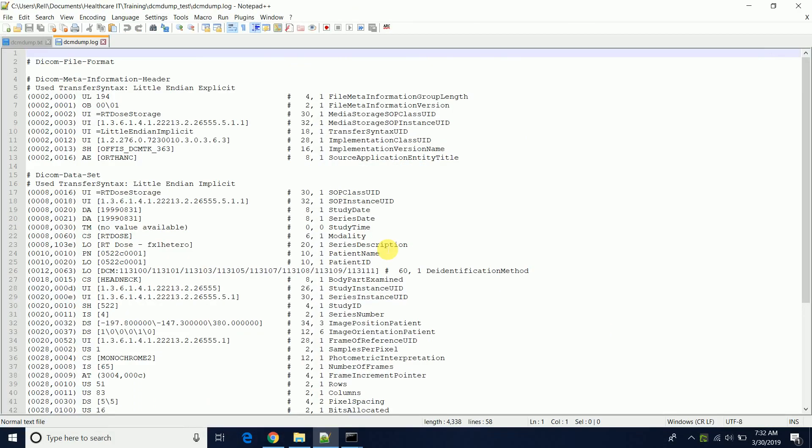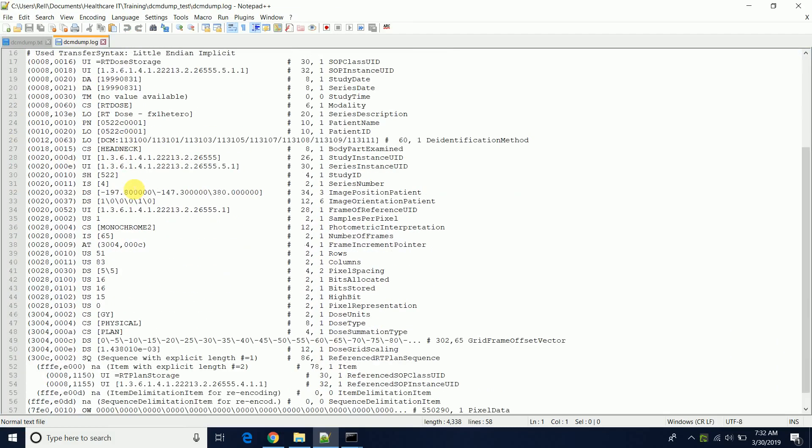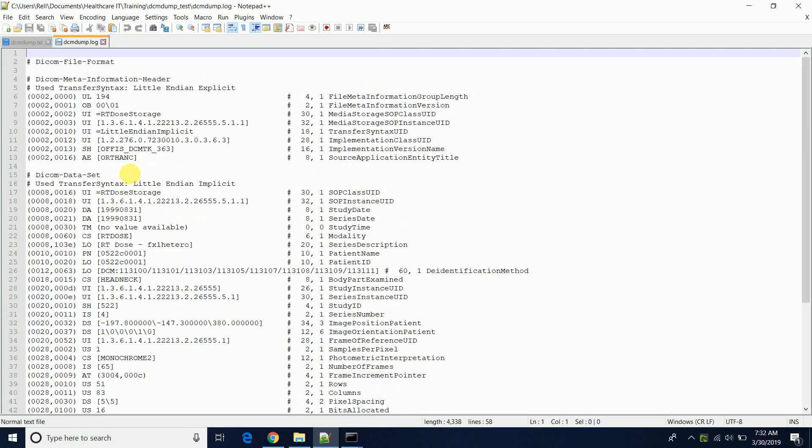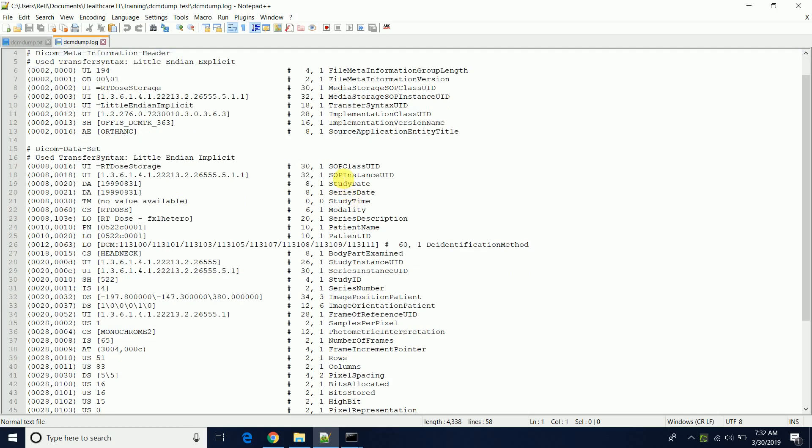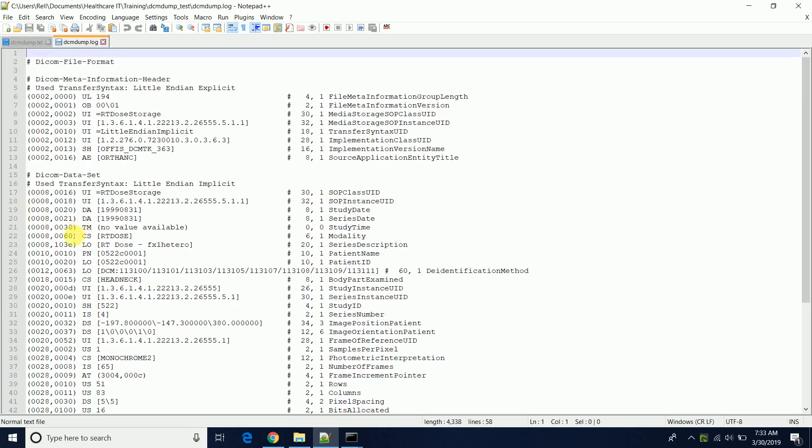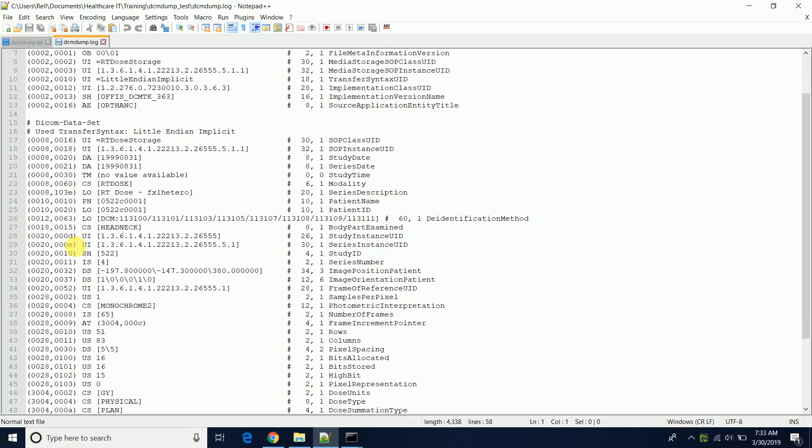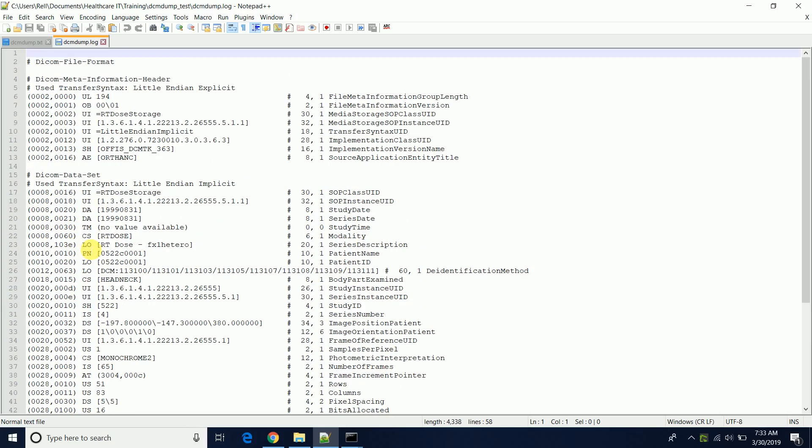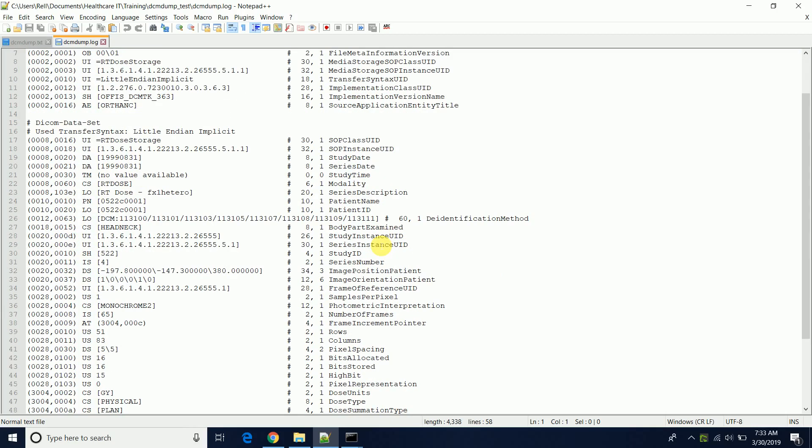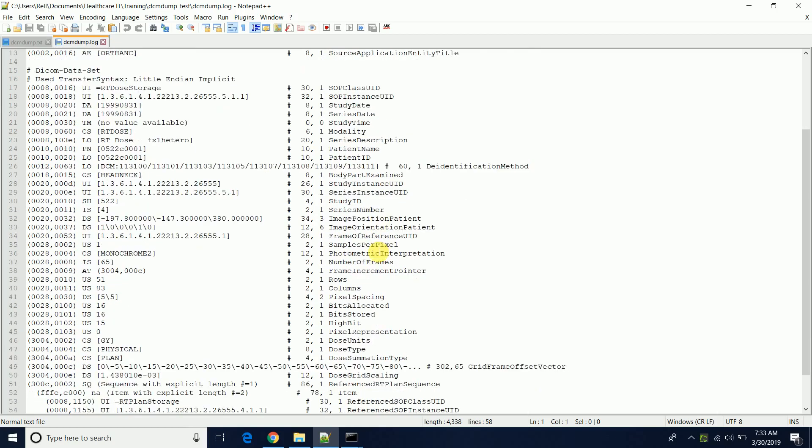You can see it displays the actual contents of the DICOM file and you can look at certain information. It has a lot of different DICOM tags such as the transfer syntax UID, the source application AE title, SOP class UID, SOP instance UID. This is how you can review it. It's pretty straightforward. You can look at the DICOM tags, what each value is, the DICOM tag, the value, and the description of what it is or the actual name of the DICOM tag.